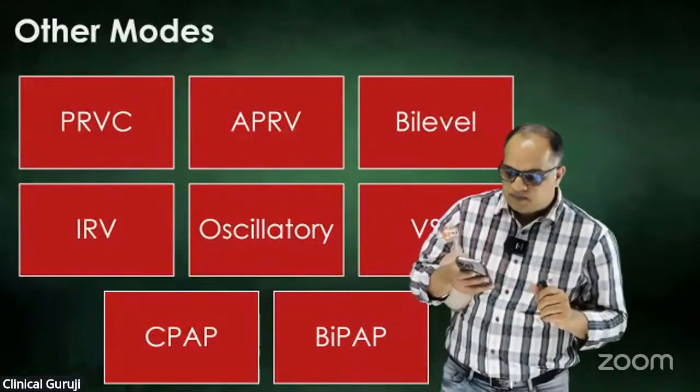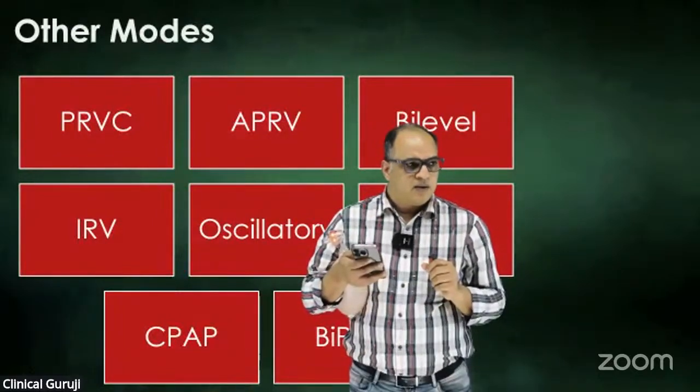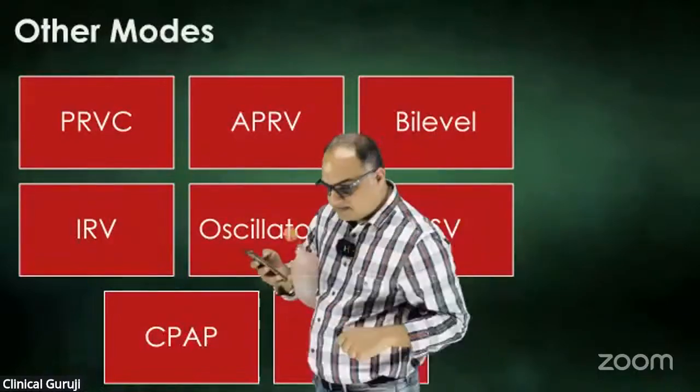Sir, one more question. If a pressure support breath is at 2 seconds, when will be the next SIMV breath? Yes, it will reset the cycle.